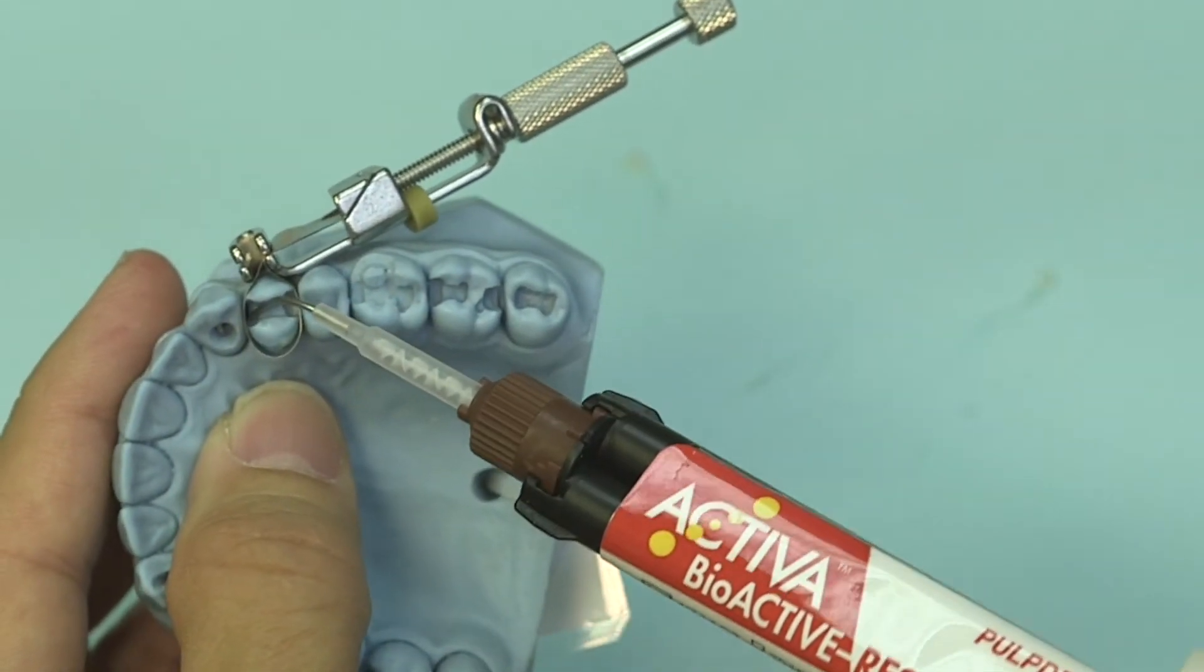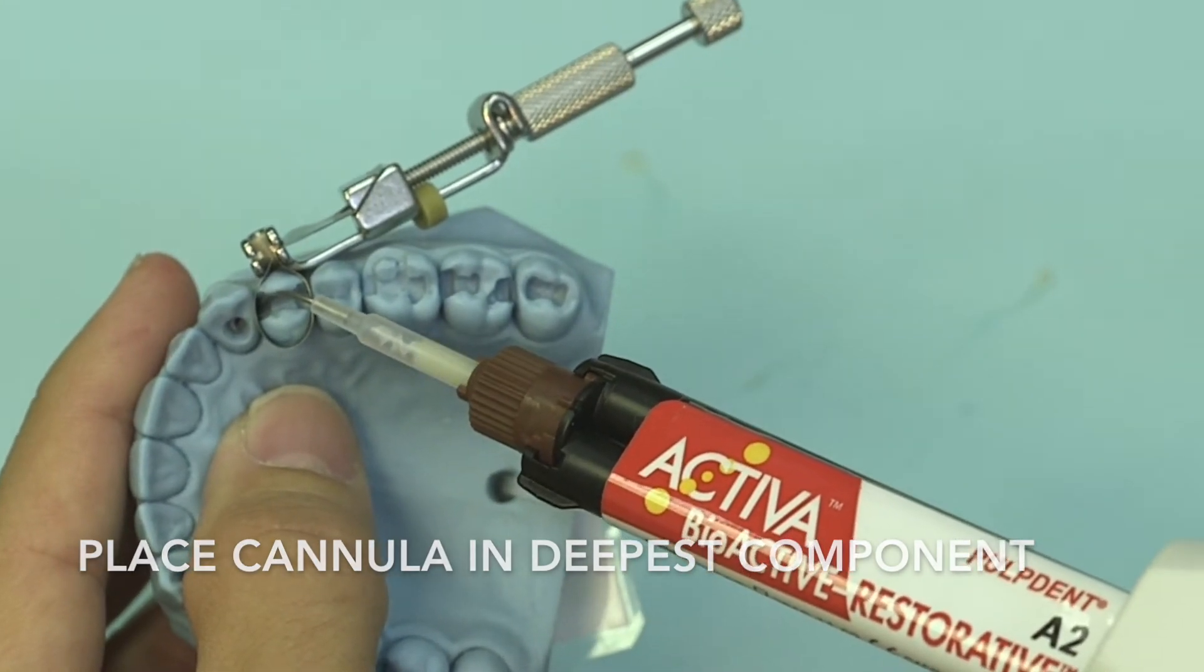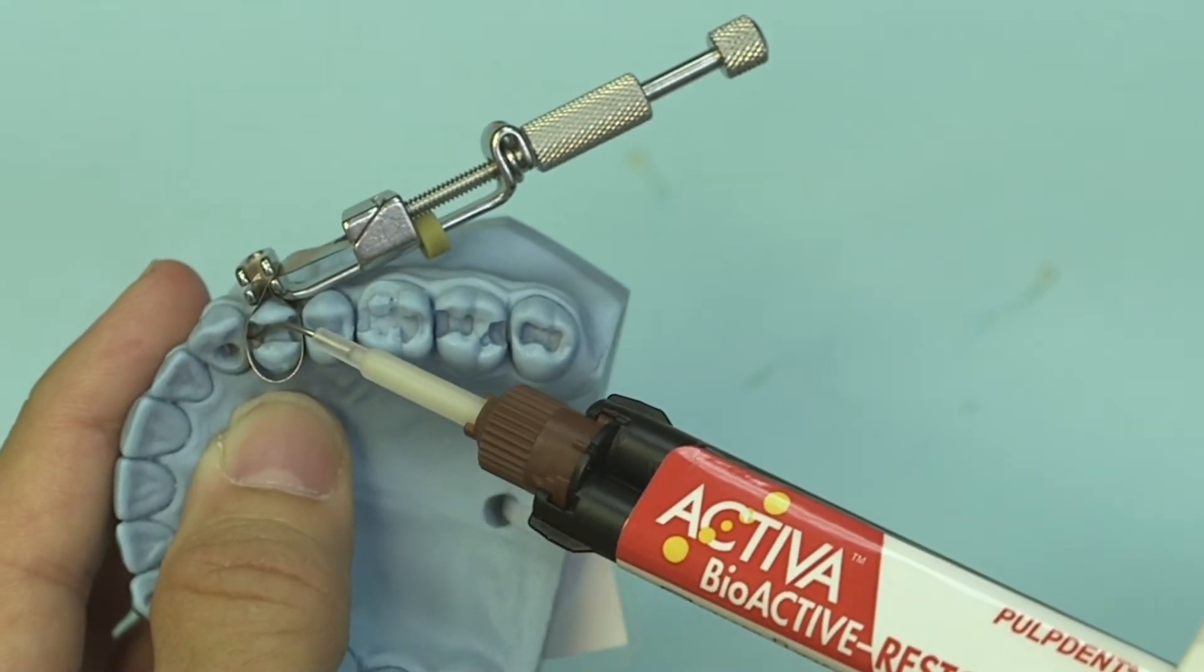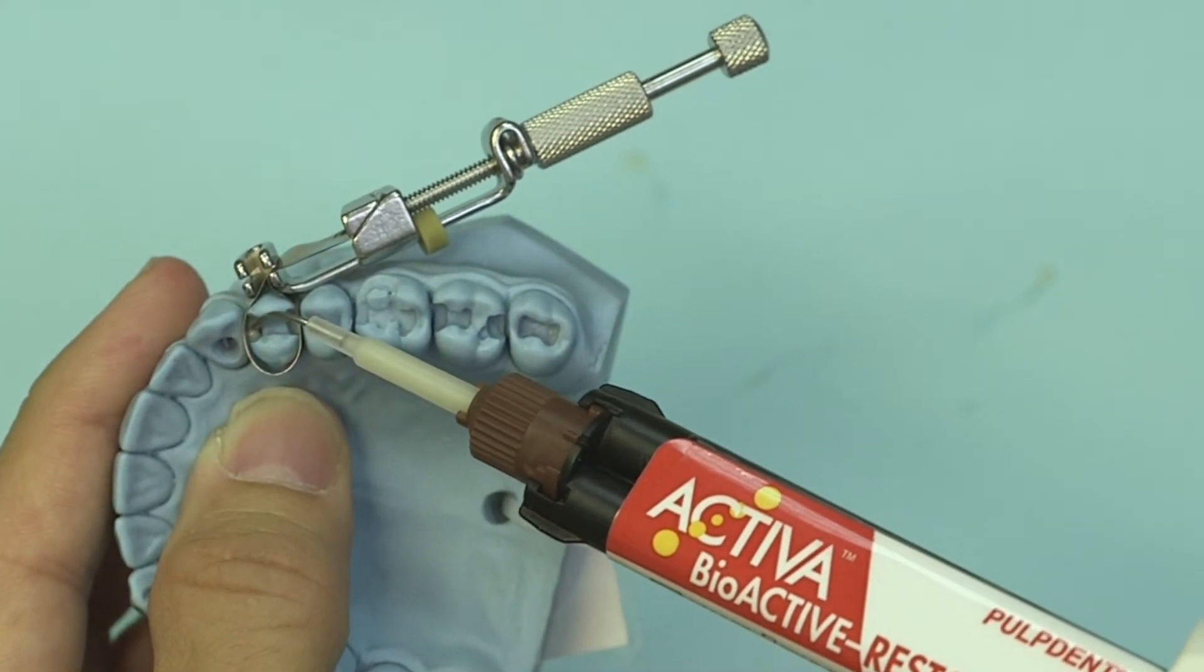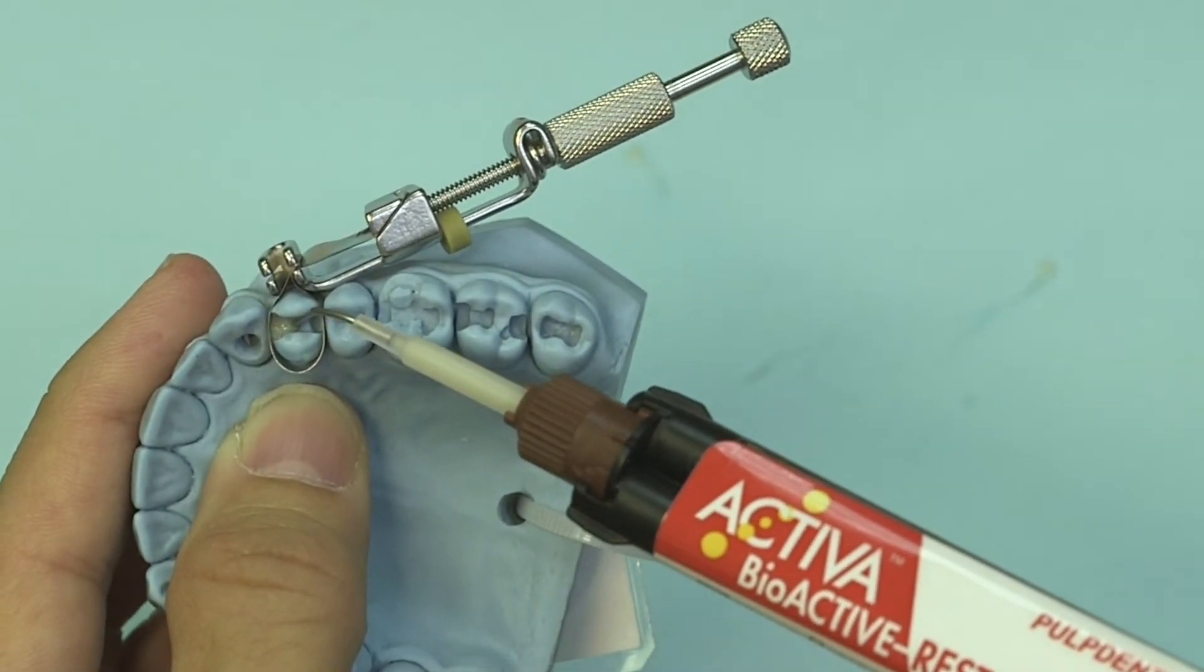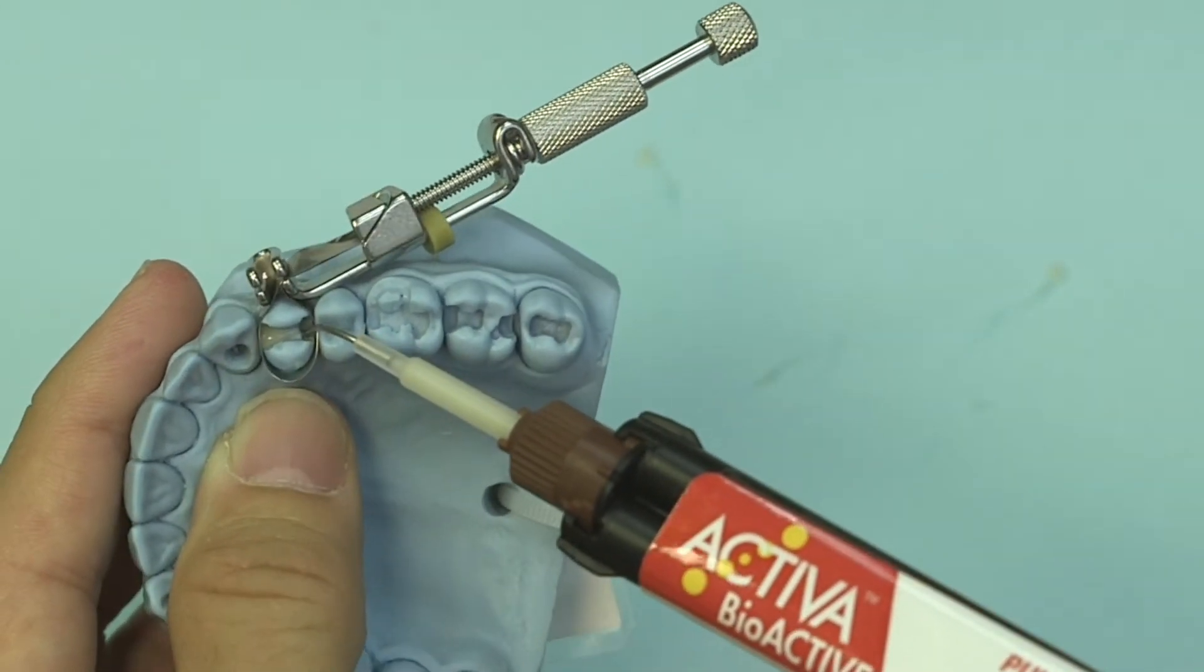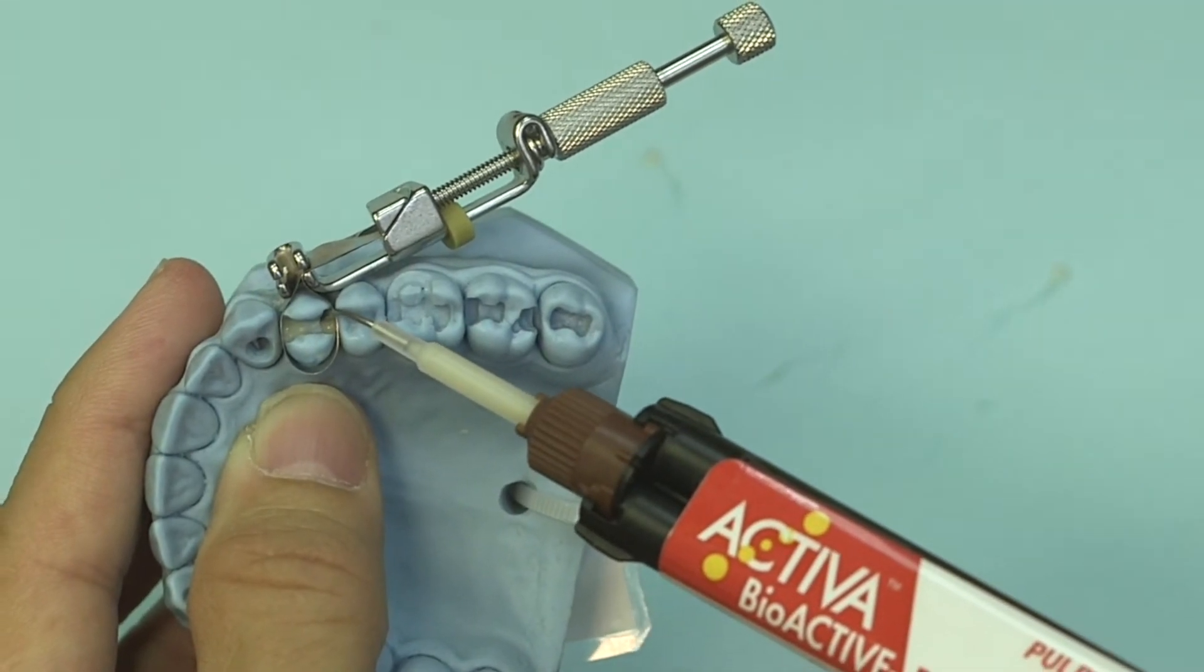What I'm going to do is in the deepest component, in the deepest portion, I'm going to place the cannula and begin to extrude the material into the box, keeping the cannula in the material and in the box and gently backfilling it. As we come up to the occlusal I'm going to drag it over the pulpal floor gently, then go down into the second box and I'm going to gently extrude it into that second area to get a fill of that box as well.